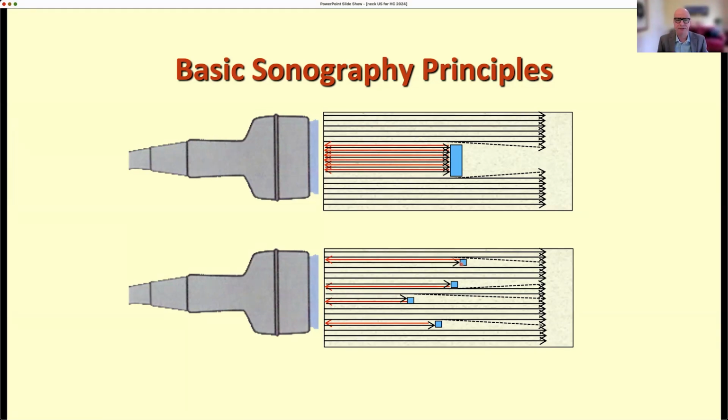So unfortunately, there is a little bit of inhomogeneity in how machines generate images. And that also applies to the software that interprets the signal received from the probe. So there is a very large variety of images that you can obtain of the same structure from different machines, something very important to remember.